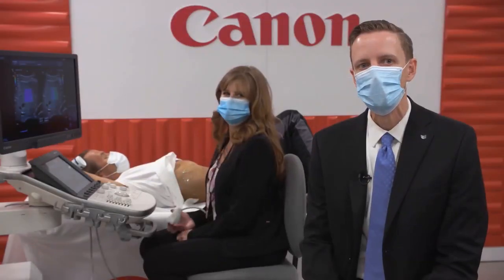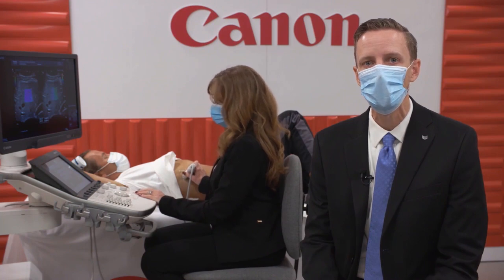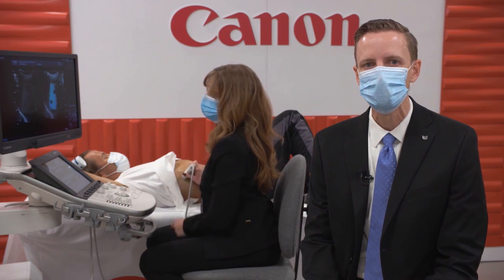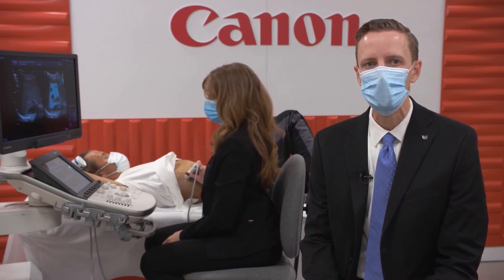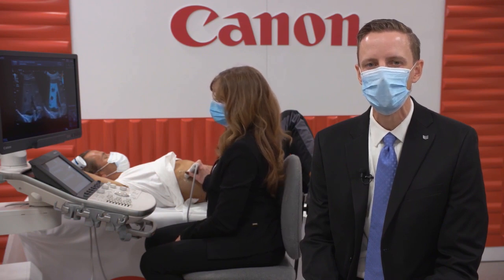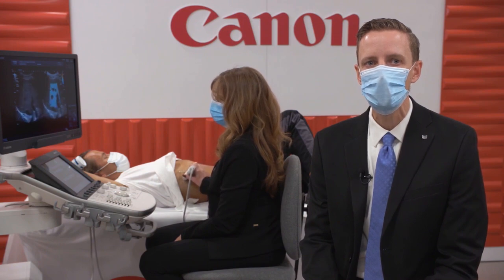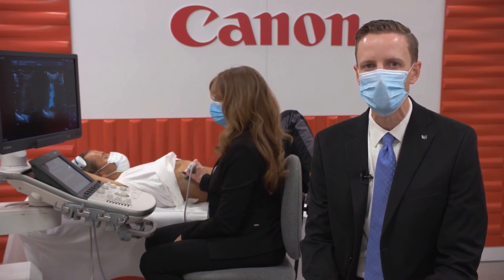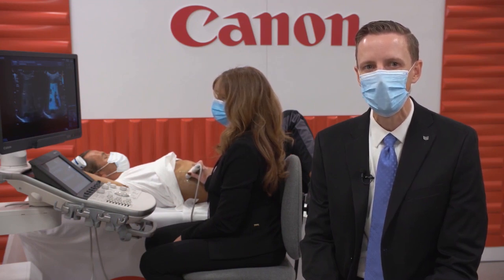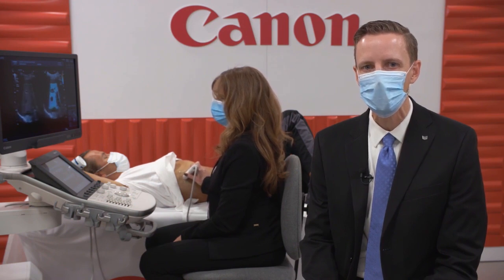Next, we'd like to show you attenuation imaging. Conventional methods for ultrasound assessment of hepatic steatosis are largely qualitative and subjective, such as comparing the brightness of liver and kidney. With attenuation imaging, we have a reliable and accurate tool for the assessment of liver steatosis that is real-time, fast, and easy to use. Recent studies have shown that the attenuation coefficient can be a valuable biomarker for detecting and quantifying liver steatosis, including mild steatosis, as compared to histopathology or MRI proton density fat fraction, PDFF.